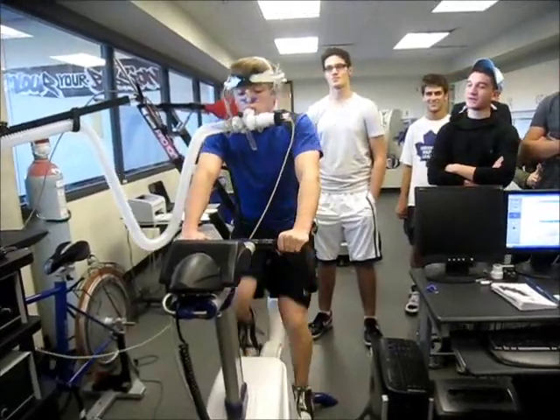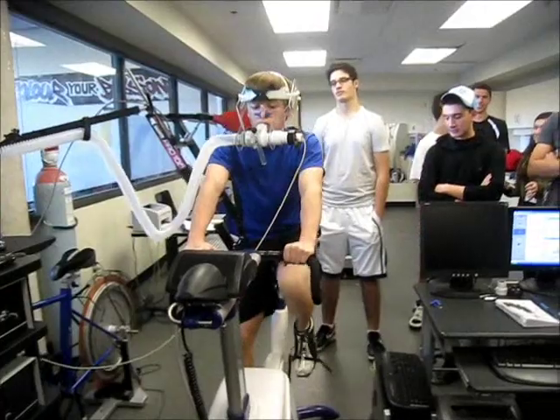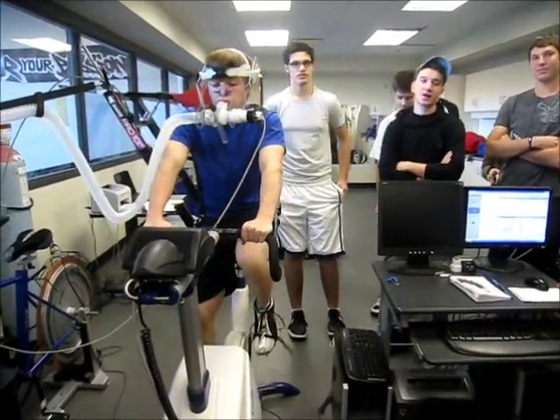He's at 200 watts — that's awesome! Oh, seven minutes in. That went by fast. How many watts does it go?